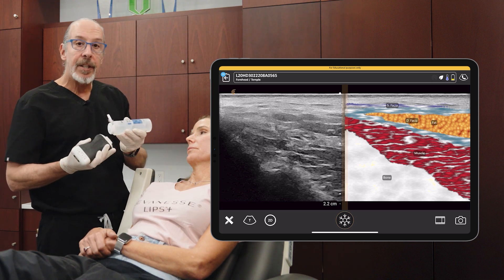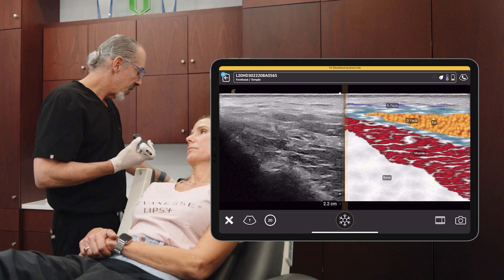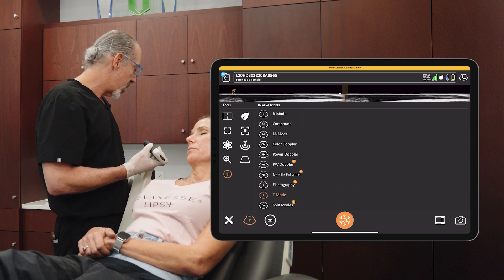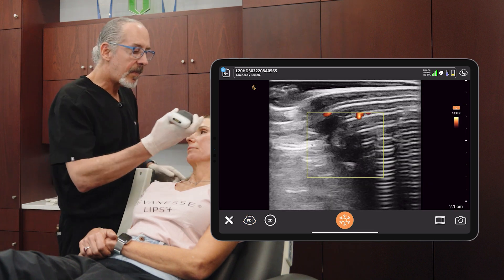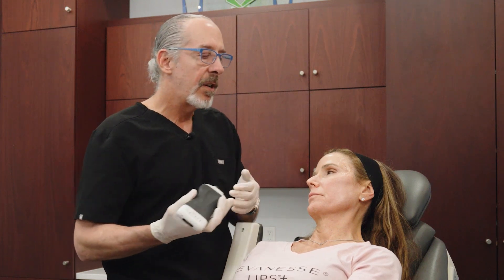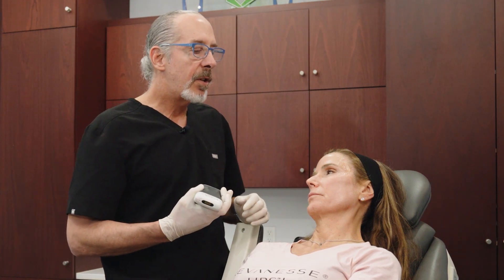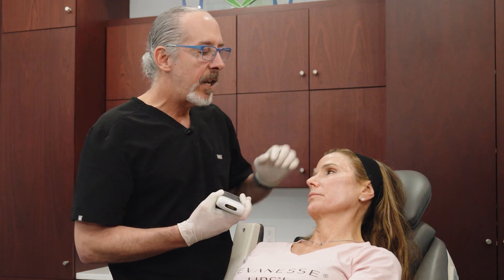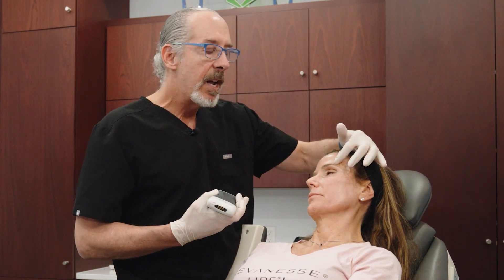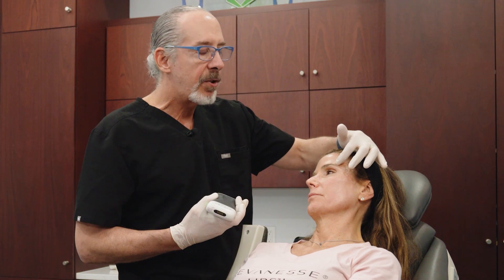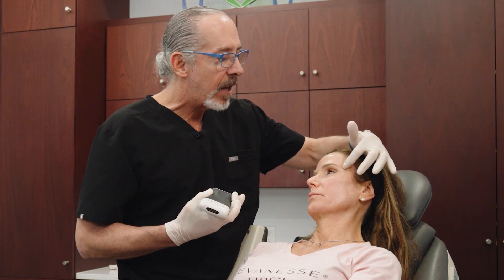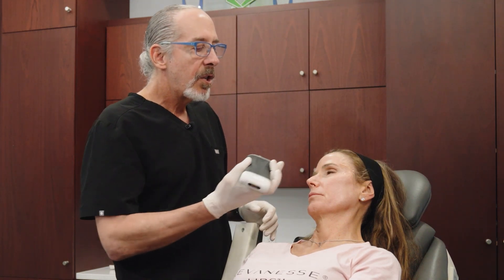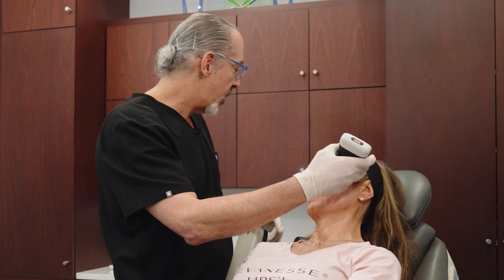Let's look at the vascular structures of the temple. Going back into B-mode and then power Doppler — there are basically superficial vessels and deep vessels. The anterior branch of the superficial temporal artery is usually in the inferior temporal septum, which runs from the superior orbital rim to the root of the helix. It's not always, but usually in a line like that, so I like to place the probe somewhere in that area.